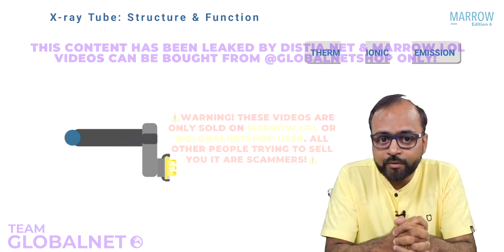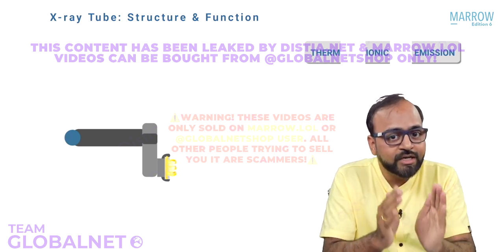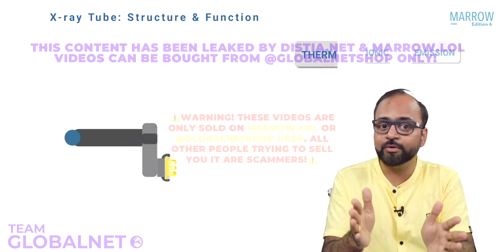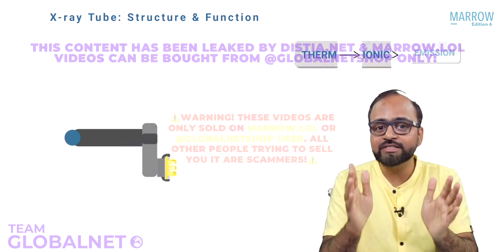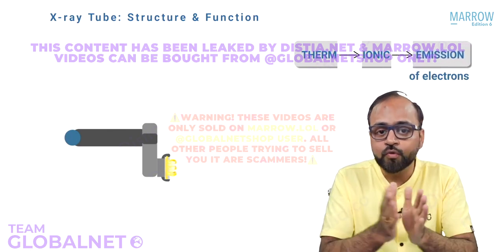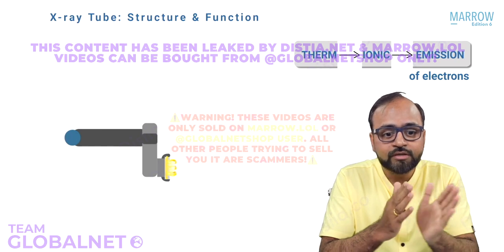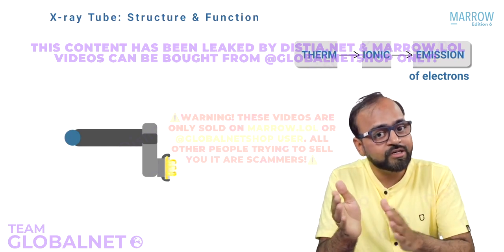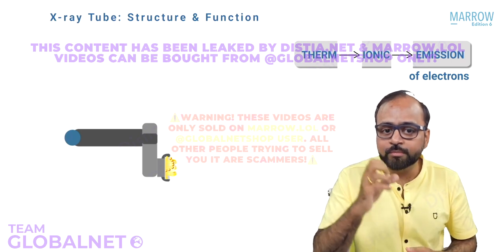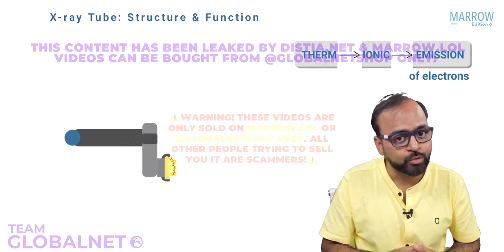Now let us see it one by one. Whenever there is thermal energy or heat which is produced, what will happen? There will be ionization. Whenever there is ionization, what will happen? There will be emission of electrons. So what is the result of thermionic emission? Thermionic emission will result in emission of electrons. Can you see there? Electrons are being emitted out from the cathode filament.